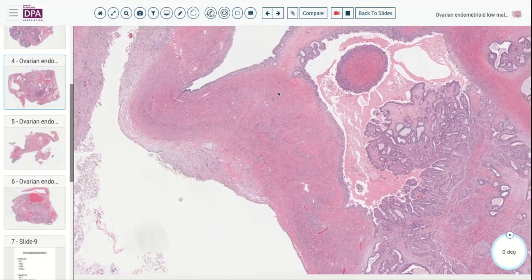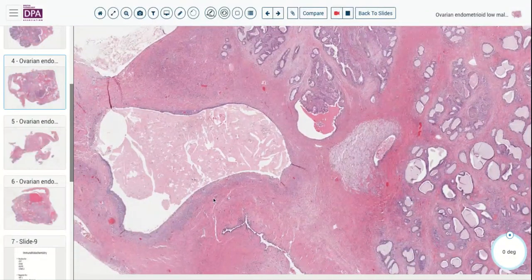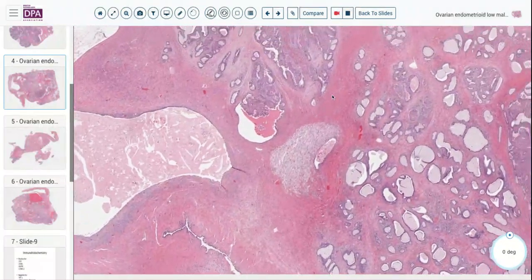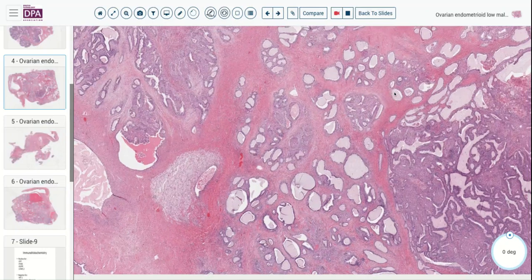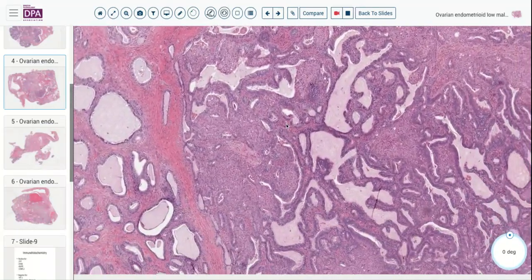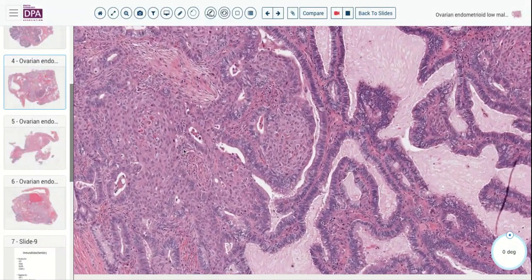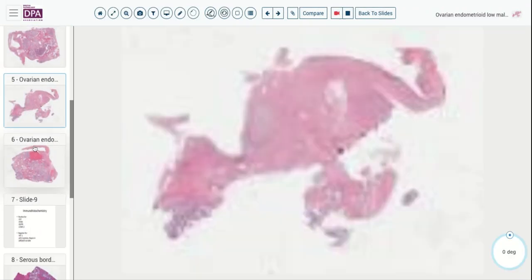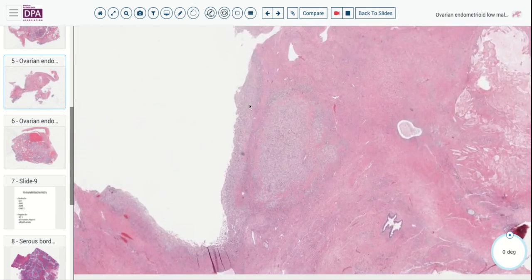And certainly this is an endometrioid tumor. Obviously, endometriosis is a very common event in the ovary, and on occasion is associated with the development of an adenofibroma, which may be benign or, as in this case, may be tending towards the borderline category, intermediate and approaching hyperplasia.